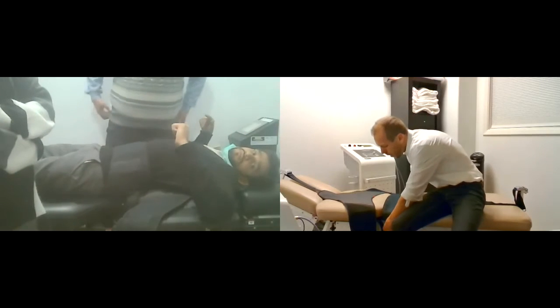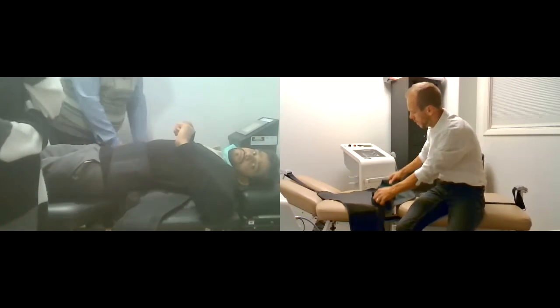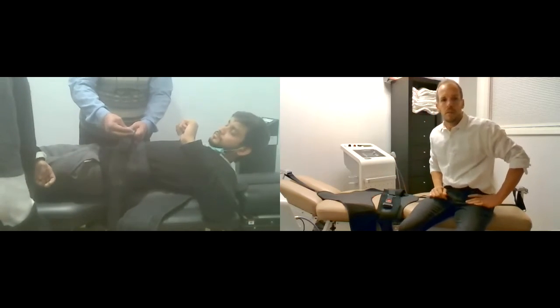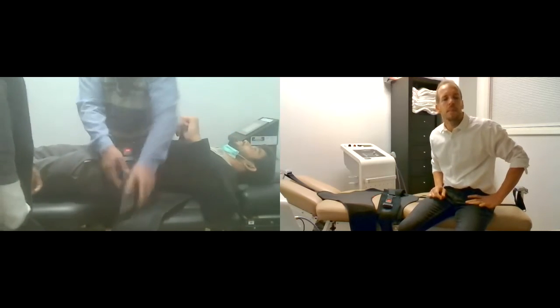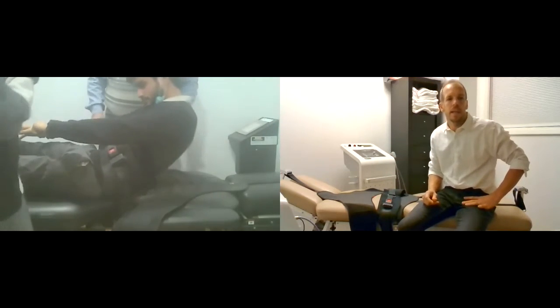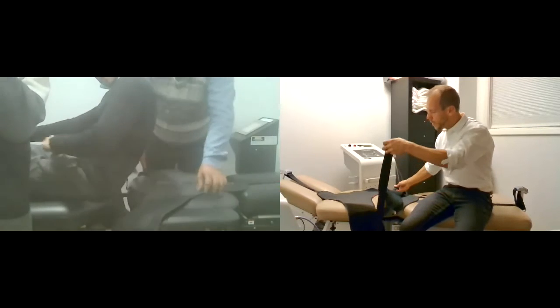Now grab your seat belt, bring that around and come straight across. Before we do that, go ahead and have him sit up for 1 second, take this seatbelt off and run it through the other way.